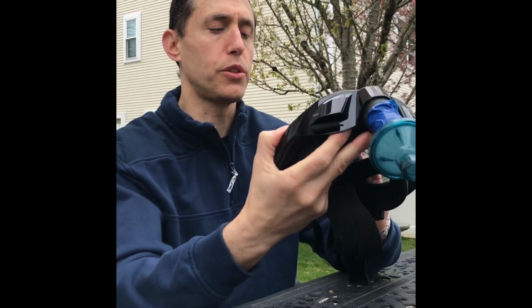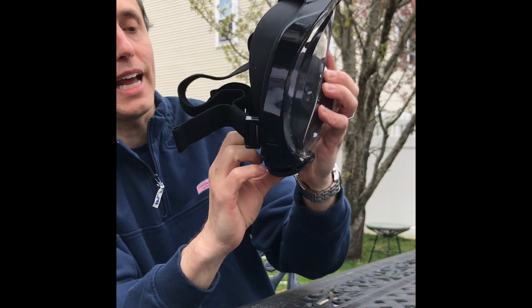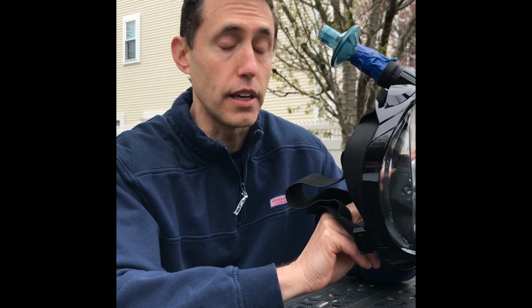One final issue is that most of these masks have a valve down by the mouth where you can exhale, and that's really designed to get water out of the mask when you're snorkeling. The question is, is that exhalation valve a problem? The main issue would be that when you exhale, what you breathe out does not go through the filter, and would that be a problem for people around you, such as if you're operating? If you're concerned about that, you can seal off that valve with duct tape.